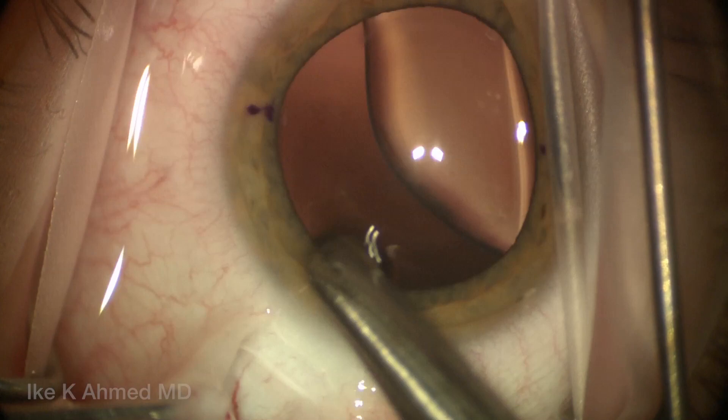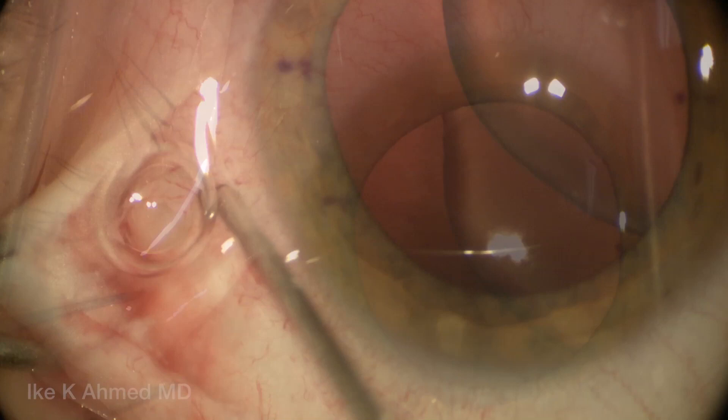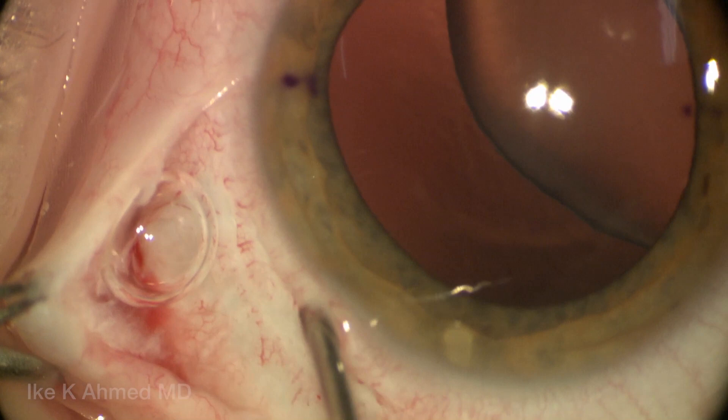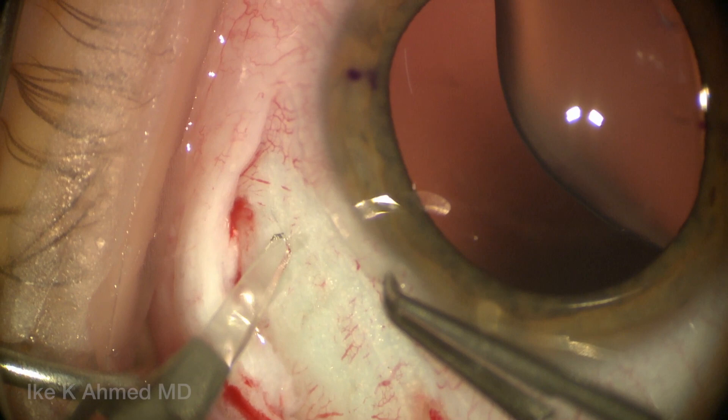We're starting off with an infratemporal localized conjunctival peritomy, which will be essentially the area where we'll fixate the segment to the sclera. The groove we'll make initially is a partial thickness — basically a one-quarter thickness groove — one millimeter back from the spur. The spur is the transition zone between the blue zone and the white sclera. In this case, this will be two millimeters back from the limbus, but the spur is really the consistent landmark upon which this groove is made.